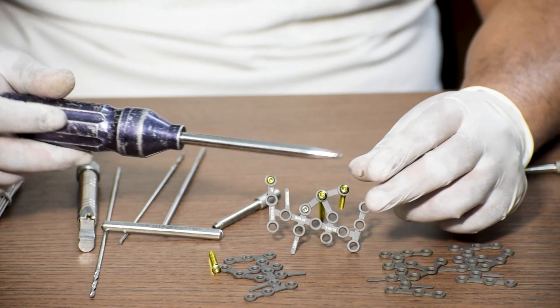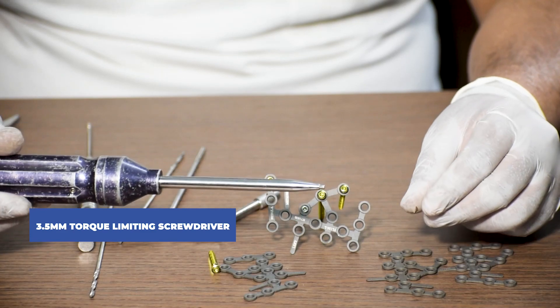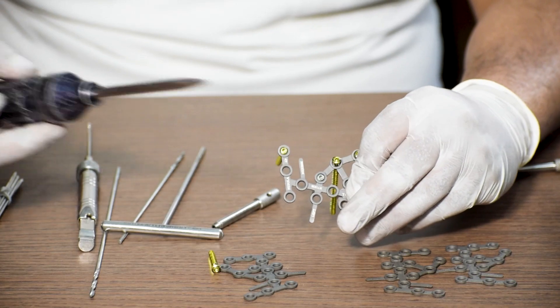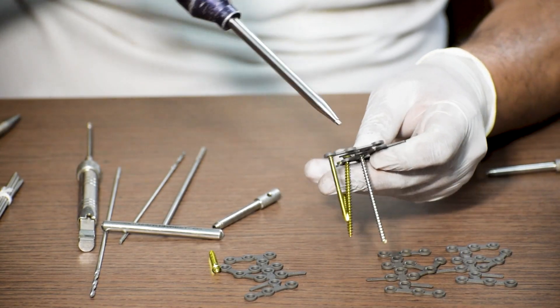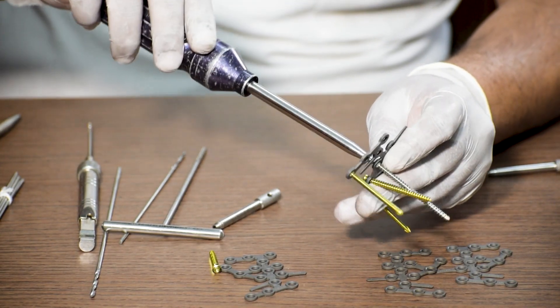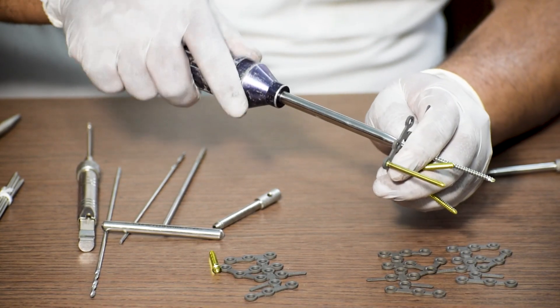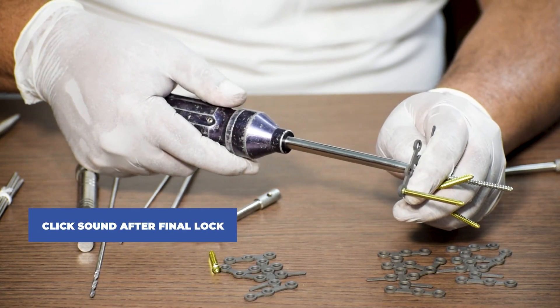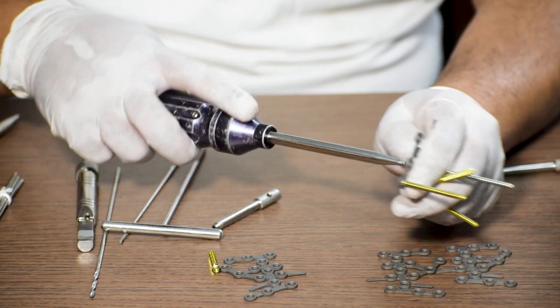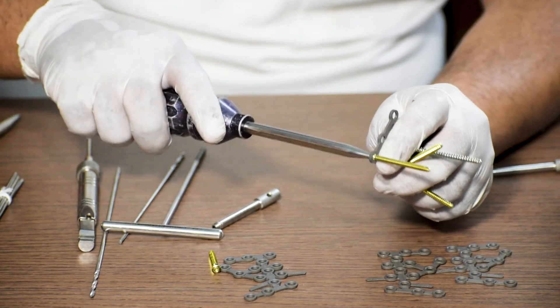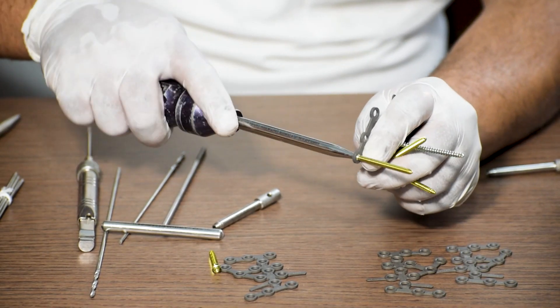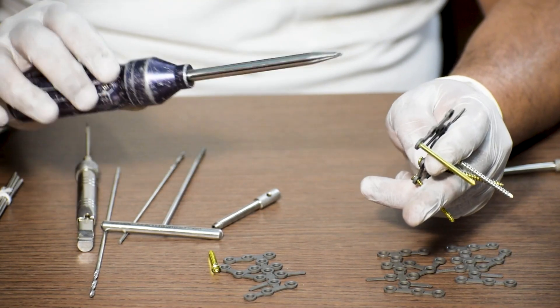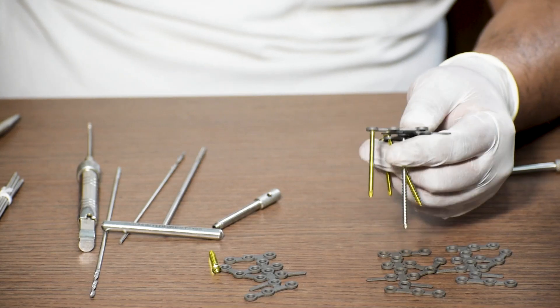And lastly we will use a 3.5 mm torque limiting screwdriver to do a final check for the locking screws. For both locking cancellous or locking cortical, we will conduct a final check with each screws by fixing it in the head of the screw and keep rotating until it makes the click sound. Once you get the click sound, you will not apply any further pressure on the screw. This device will be only used for the locking screws.